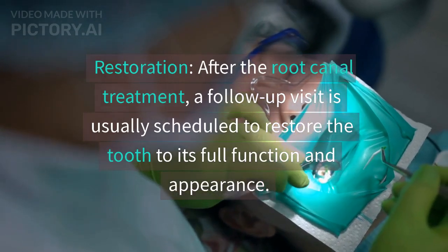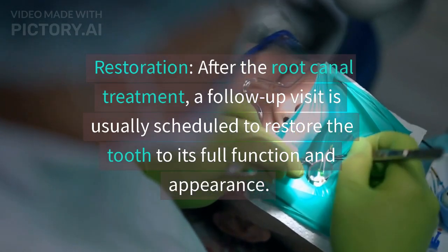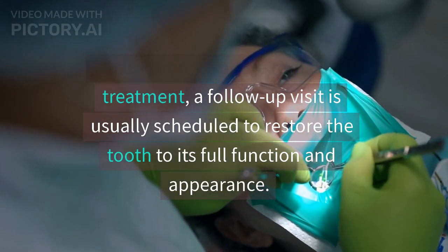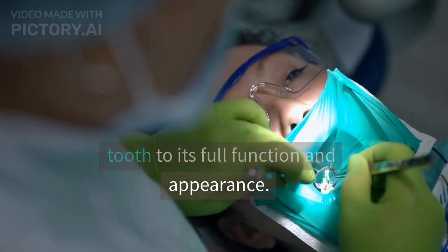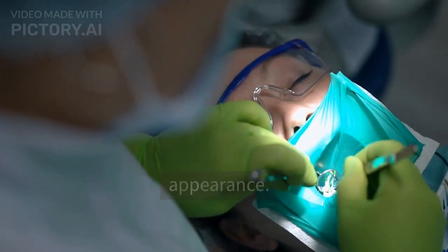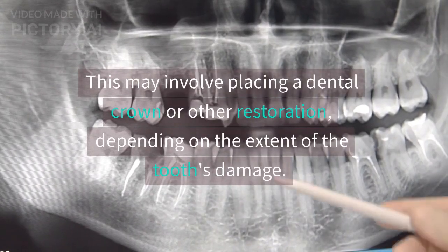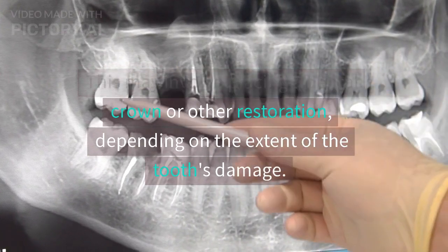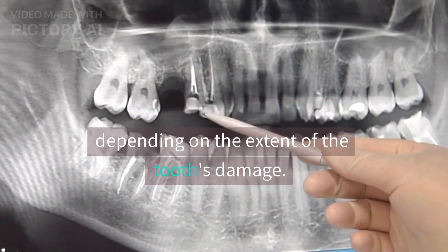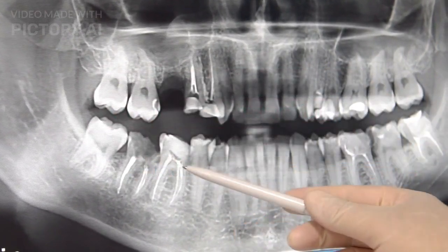Restoration. After the root canal treatment, a follow-up visit is usually scheduled to restore the tooth to its full function and appearance. This may involve placing a dental crown or other restoration, depending on the extent of the tooth's damage.